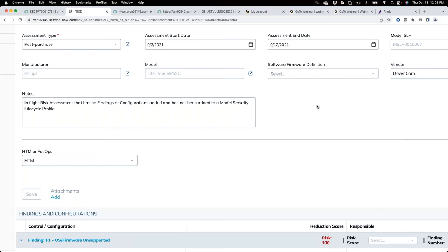Yeah, you're spot on. The only element I would add is Armis is only going to catch those devices that are connected, right? And so that's where there's still a need for manual intervention. Within the context of Nuvolo, when you create a recall, it's simply filtering which devices need that recall. And this has been really helpful even if you didn't have Armis, like the Alaris pump, if I'm running 9.33.2 and I have that in the technical information, then I can focus anytime there's alerts only tied to that. I'll have the ability to create that manually. It's a lot simpler on the network connected devices because then Armis is pushing it to us. If it could show up, track the database, and then whenever we implement the solution, track it down, right?